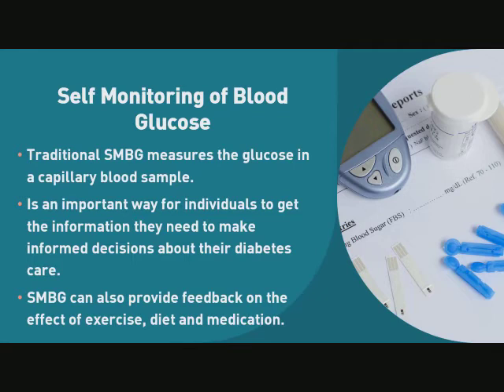The diet, for example, many people would ask, what if I eat a fruit salad, or what if I eat pasta? Is it going to raise my blood glucose or no? If you want to make sure, then check your blood sugar first, blood glucose, and then take the meal, and after 2 hours check again and see how much this meal raises your blood glucose. It also shows us if the medication that we're taking is effective or not.